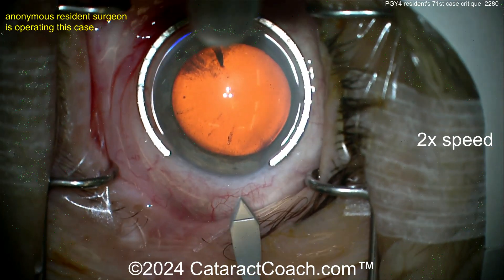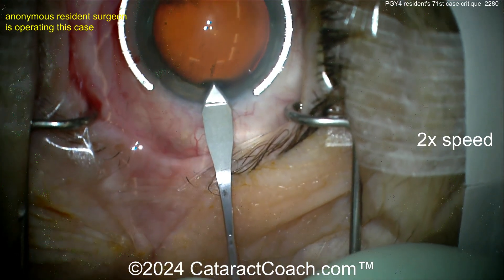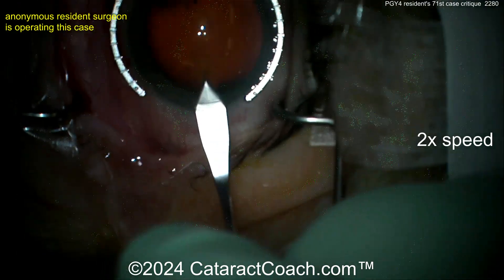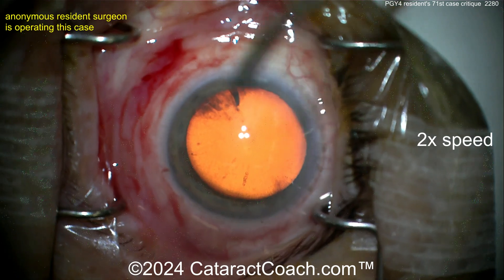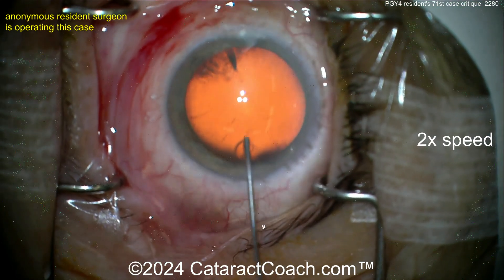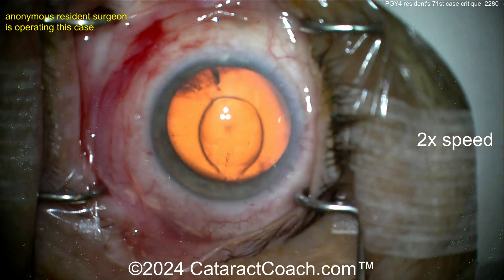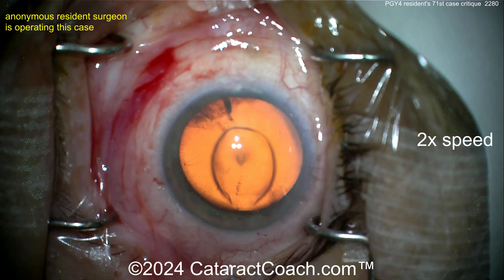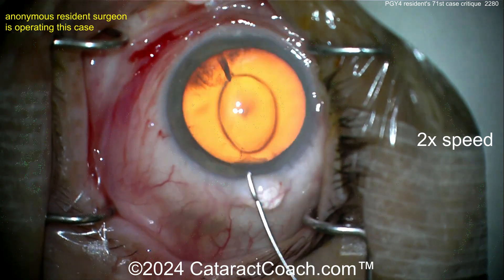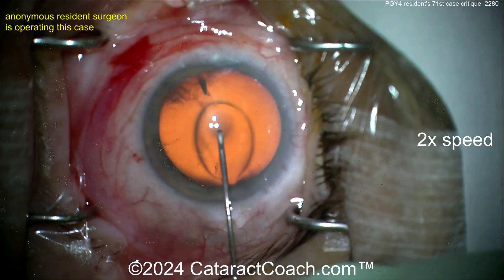The main incision looks pretty good — a two-plane kind of effect, pretty reasonable. Now let's see the rhexis. A little more viscoelastic — like a soft shell technique, that's reasonable, but it may obscure your view a little bit as you try to get the rhexis done. Here comes a cystotome — turn that thing sideways so you don't chew up your incision.